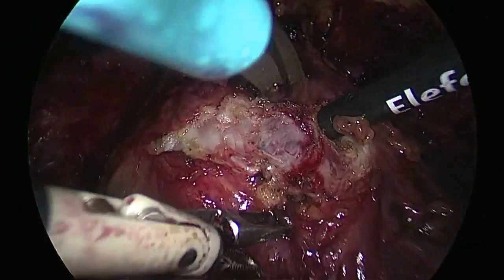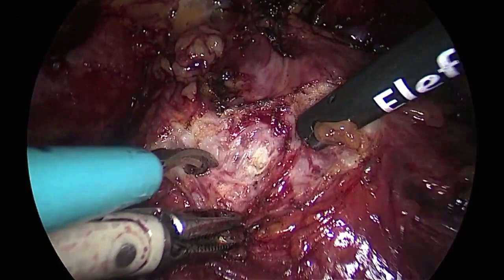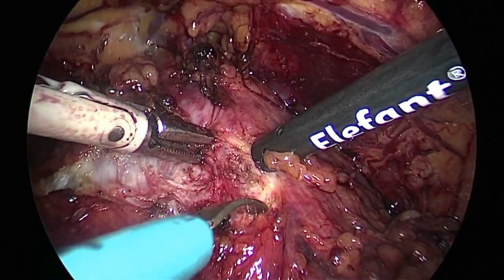Can you hear me, Francesco? This is okay, Peter, I'm hearing you. So I just wonder, when I do this operation, I normally start by putting a suture around the dorsal venous complex. Do you not do anything like that? Can you repeat, Peter? Yes. When I do this operation, I normally start by putting a suture around the dorsal venous complex, but I see that you don't do that.